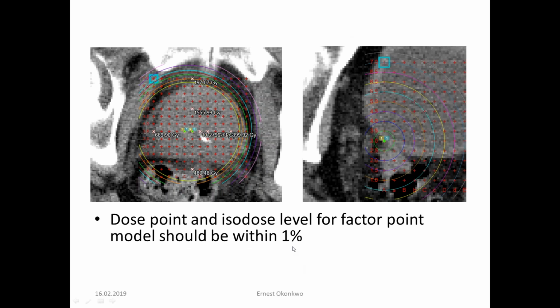You take a snapshot of those points, and as I mentioned previously, you have the specification of the source you are using. So in that specification, you have what you are supposed to get. You look up on the table provided by the vendor whether the dose at this point is what is required, if it's accurate. And then you place the second point, and you try to find the sum of it.